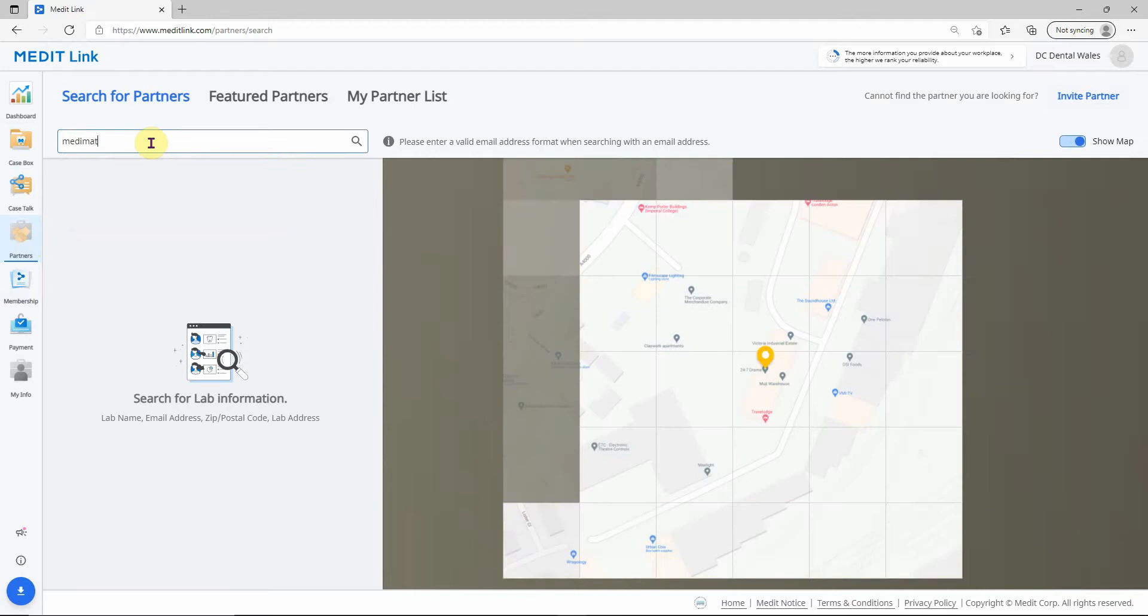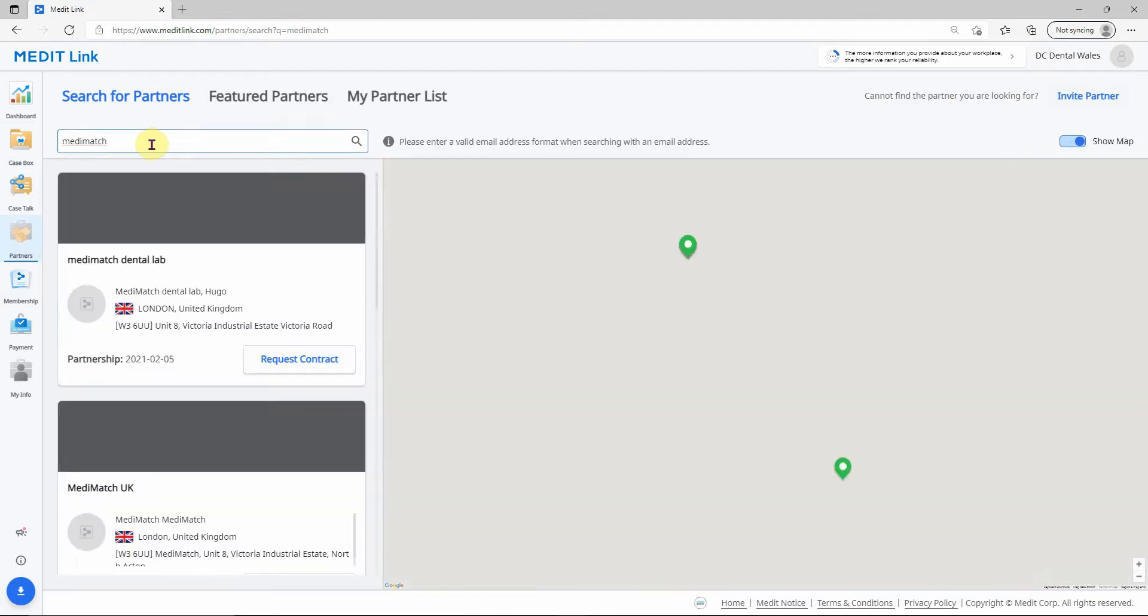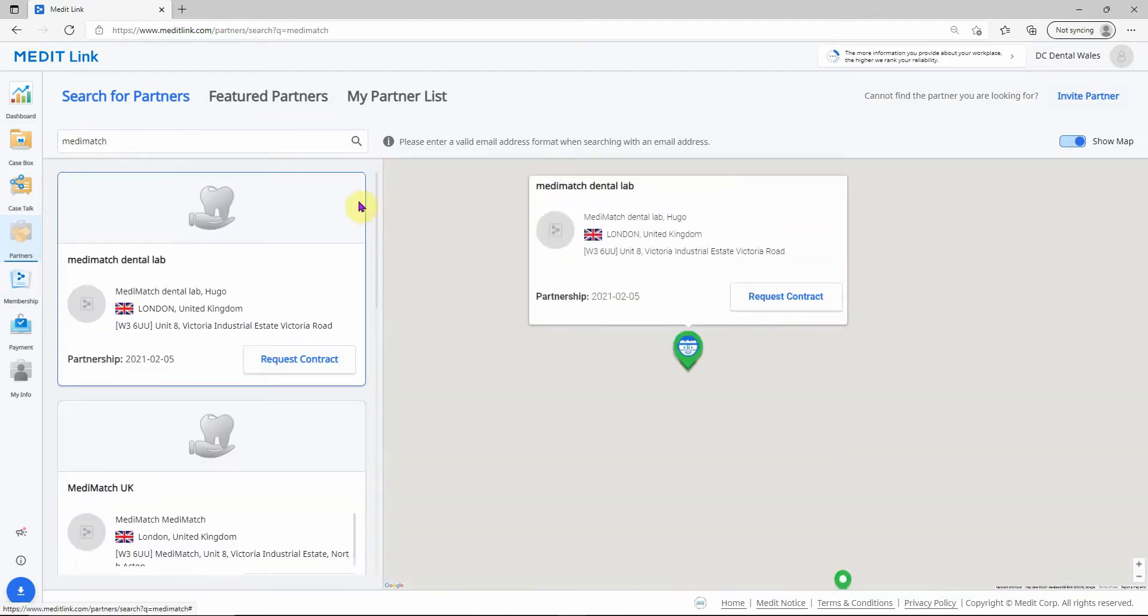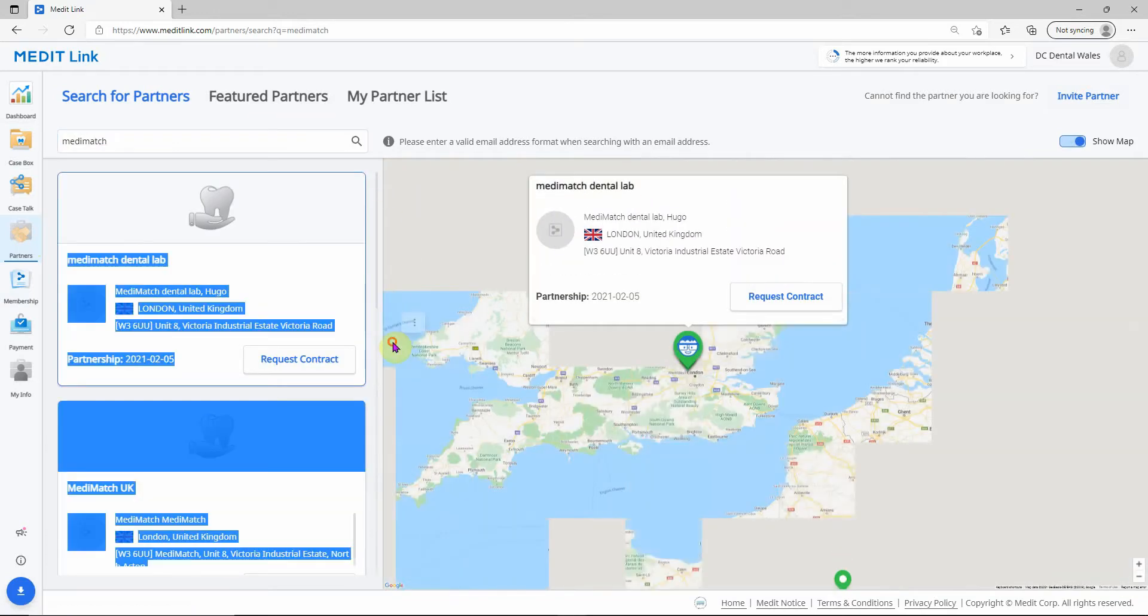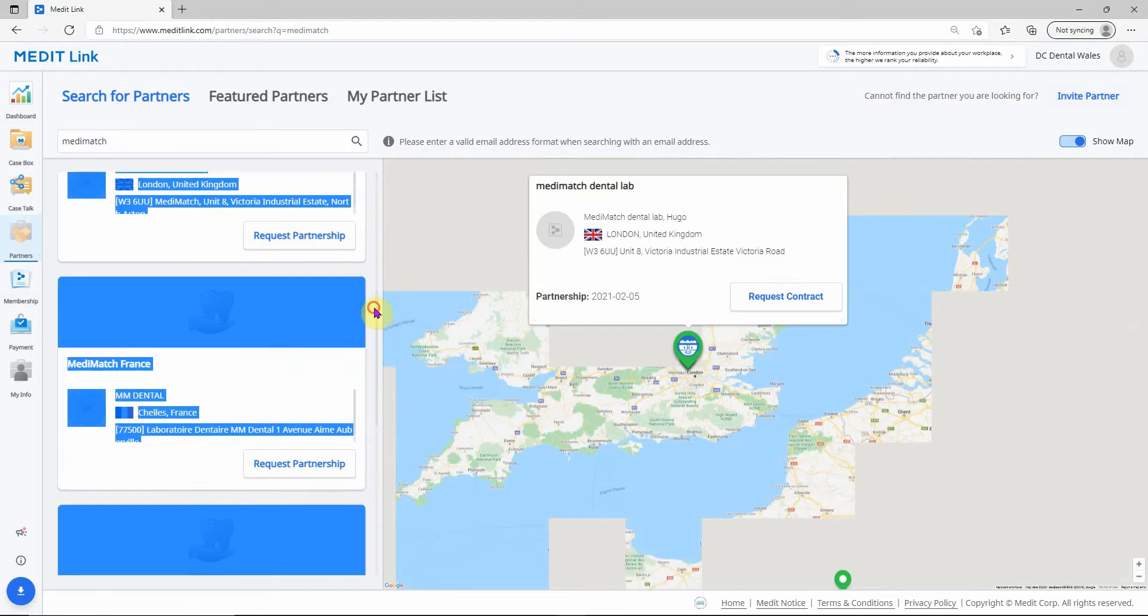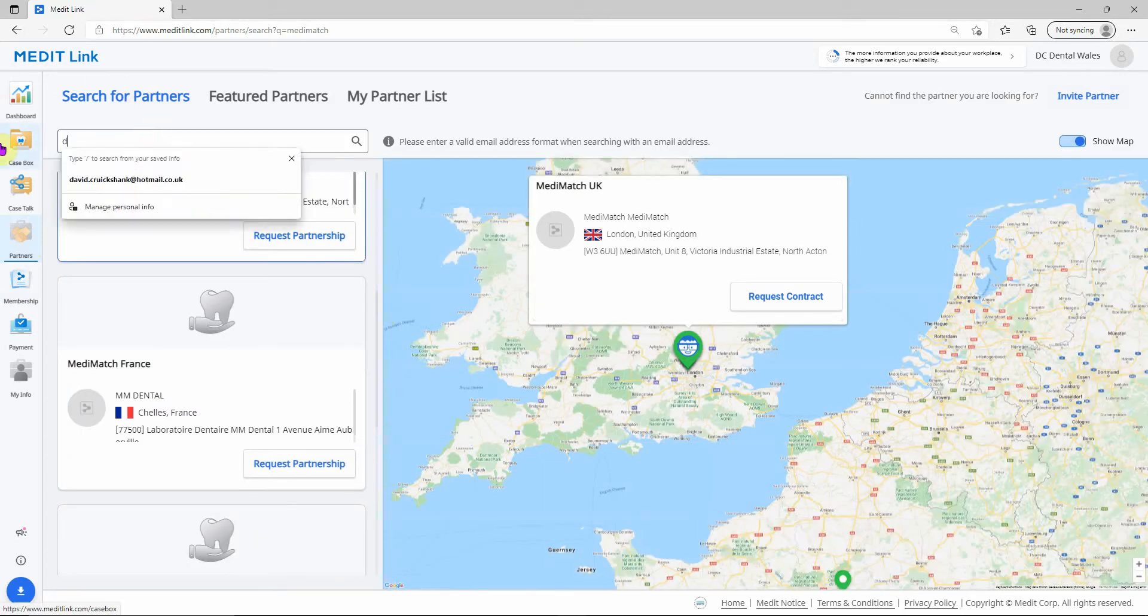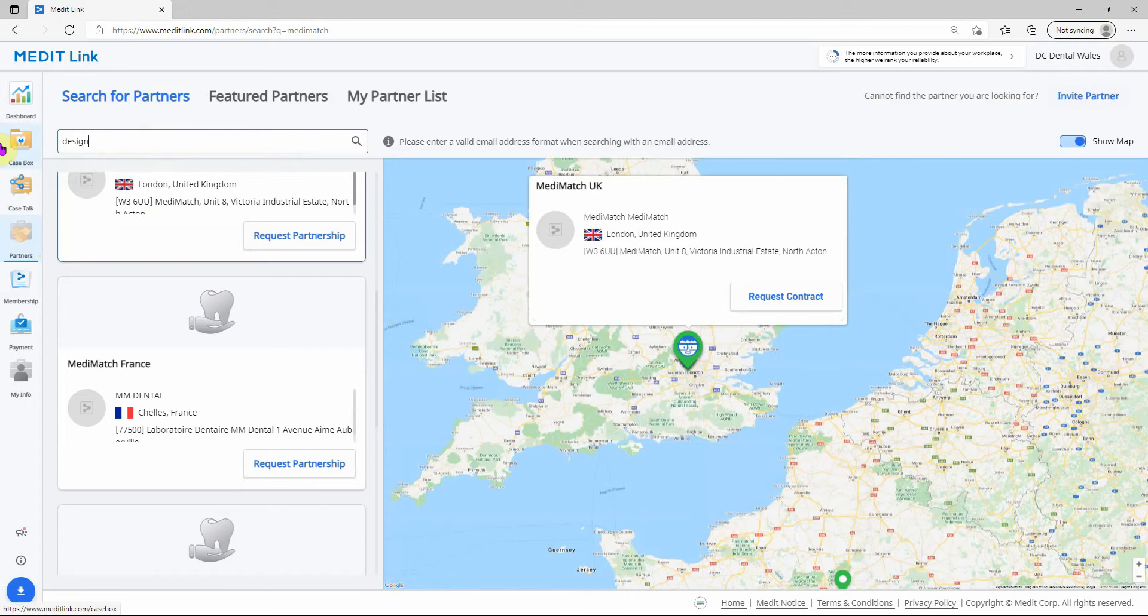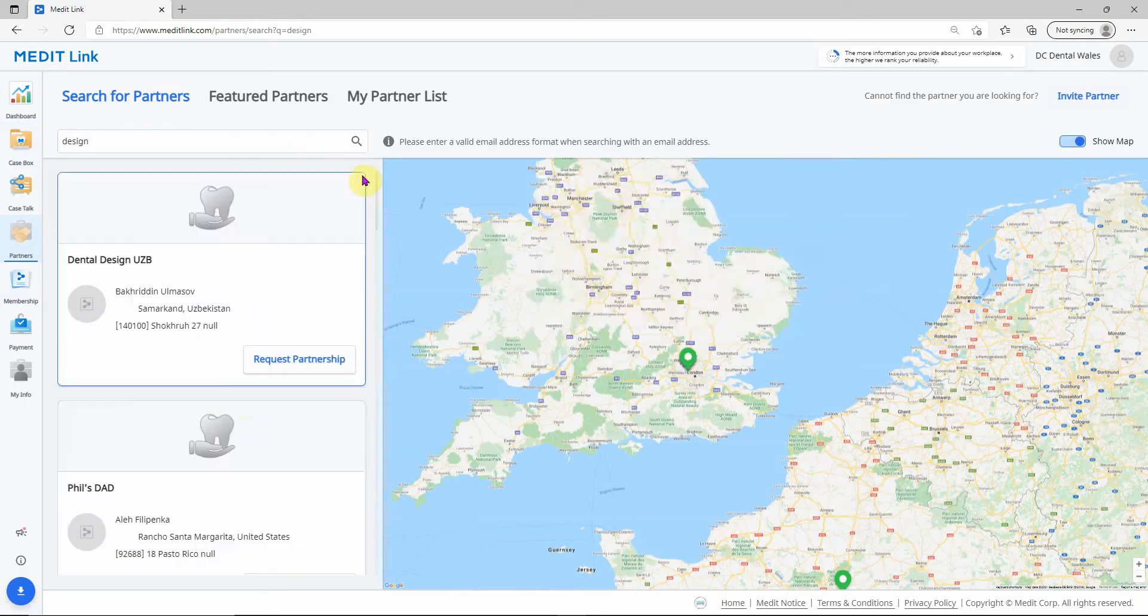I searched for Medimatch, and it shows you all the different Medimatch labs around the world. Whichever lab you're looking for, just type it in, search for it, and click request partnership.